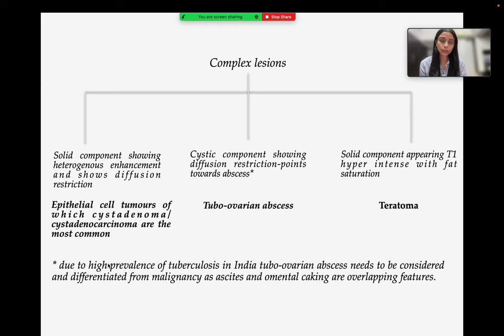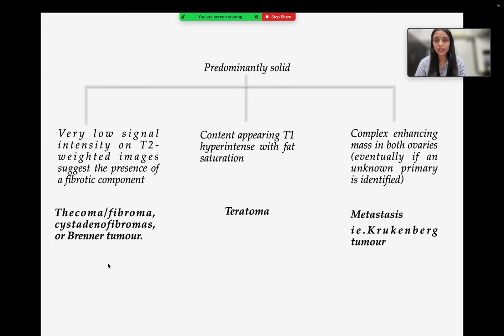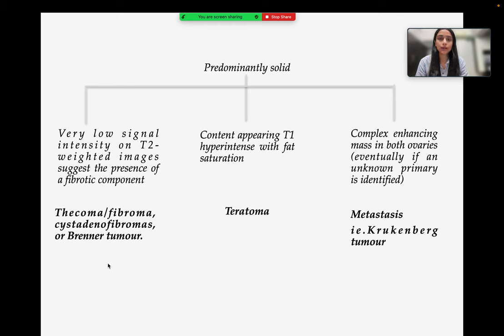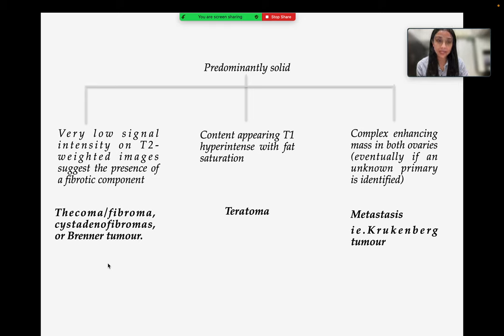If the solid component shows fat intensity, teratoma is to be considered. If it is a predominantly solid lesion with very low signal intensity on T2-weighted images, it suggests the presence of a fibrotic component, indicating thecoma, fibroma, cyst adenofibromas, or Brenner tumor. If it is a complex enhancing mass present in both ovaries and an unknown primary is identified, metastasis is the diagnosis.